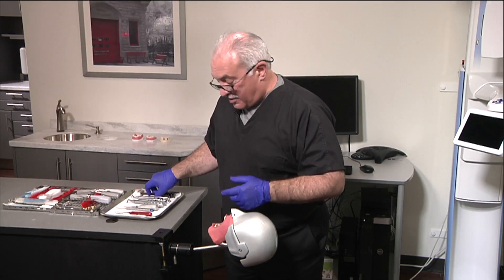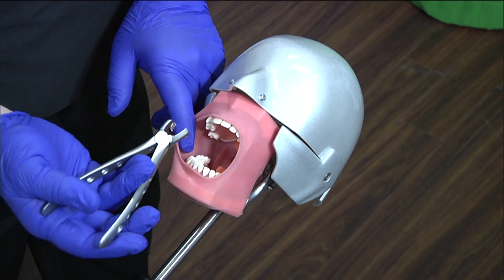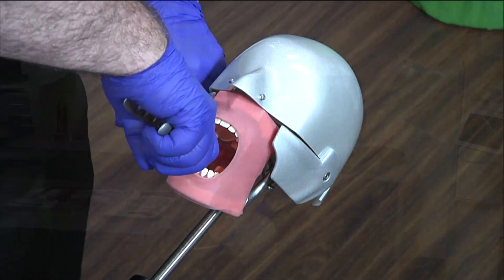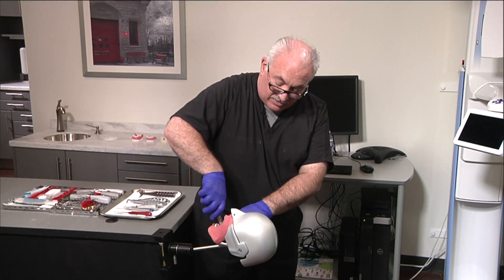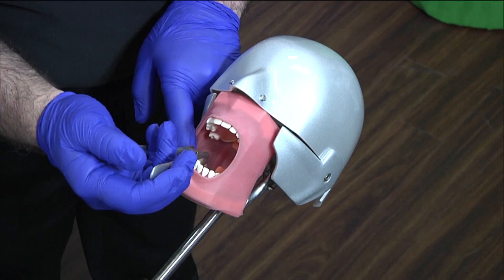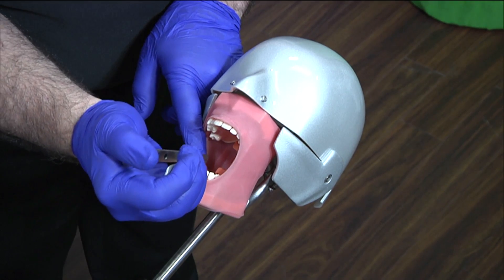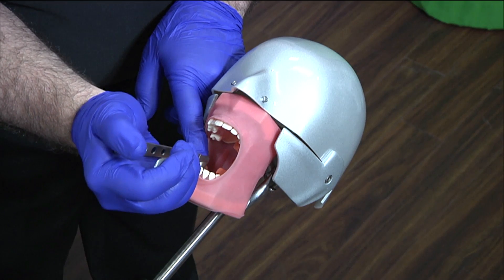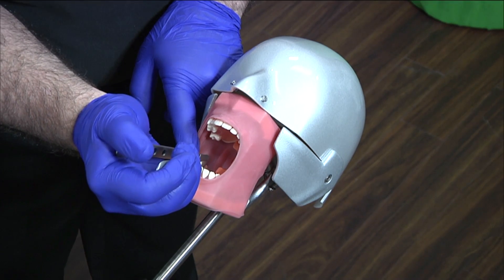In the mandibular arch, let's say I'm taking out number 30. I've done the same steps with the PH2, the luxator, and the traditional technique would be to come at this like this — you rotate around and you're doing a figure of eight, buccal-lingual. But what I'm trying to teach you is to seat the forcep and gradually just pump, then rotate. Slowly rotate. You may have to do several cycles of this, and finally you'll feel the tooth starting to release.